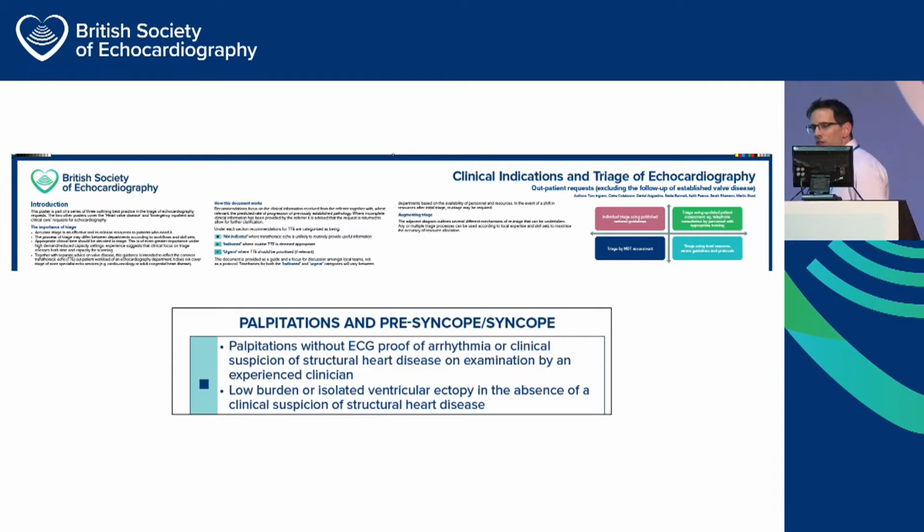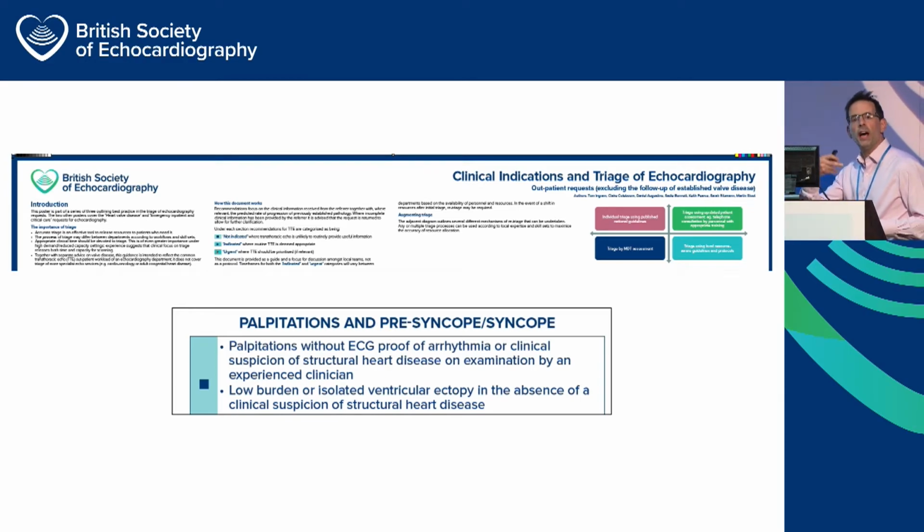And just to show that we practice what we preach at the BSE, we've very much attached that 5 minutes worth of clinical reasoning into our clinical triage guidance, and we put down as not indicated various situations of palpitations like I'm describing there with ectopic heartbeat sensation, low burden of ventricular ectopy, or a clinician who's happy that there's unlikely to be structural heart disease underneath, no murmurs, normal 12-lead ECG.